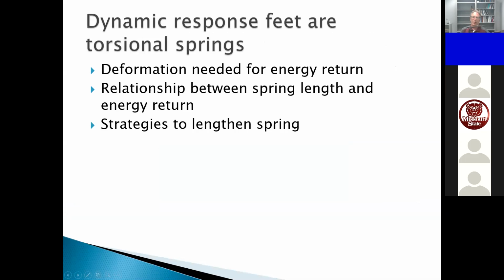Here we go. Okay, so this looks a little bit like a blade. I'm going to show you a little bit more closely, right? But what it really is, is a torsional spring. This is one for walking, not one for running, although I think that somebody could do some running in it, but it's not especially made for running.